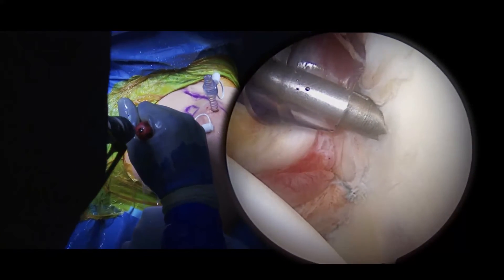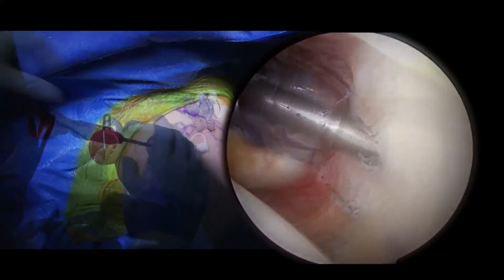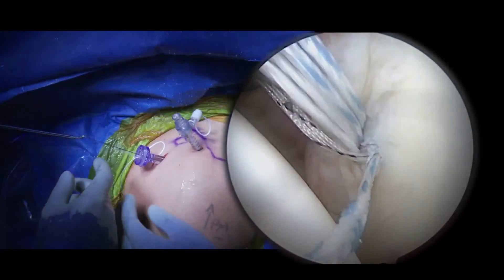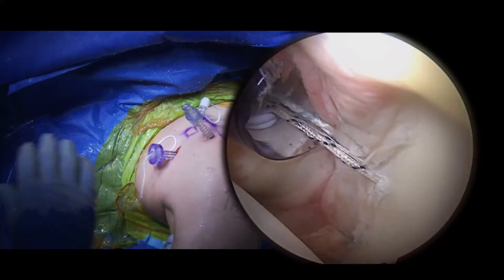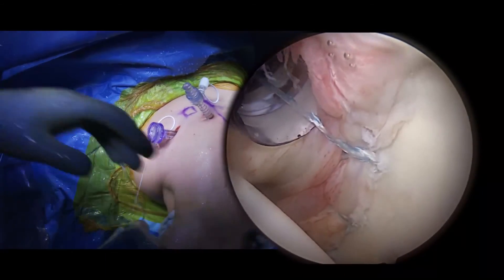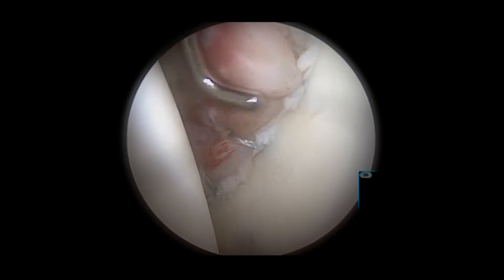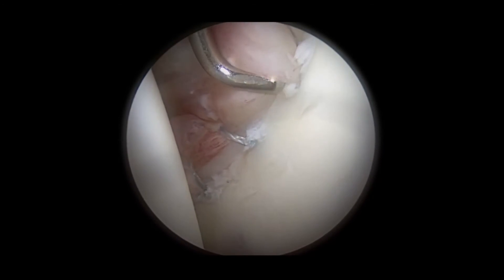Sequential anchors are placed in a similar fashion, with the second typically placed at the level of the anterior band of the inferior glenohumeral ligament, followed by a third anchor at the level of the middle glenohumeral ligament, and finally a fourth to facilitate repair of the anterosuperior labrum. The final repair construct is probed thoroughly to ensure complete stability of the reconstructed labrum.